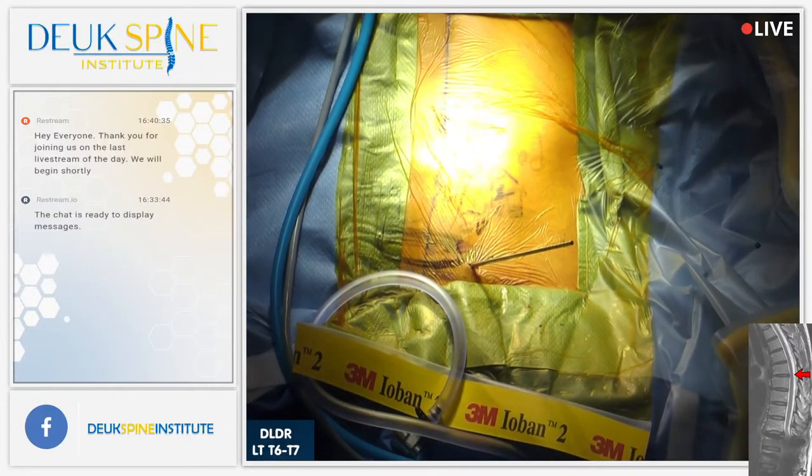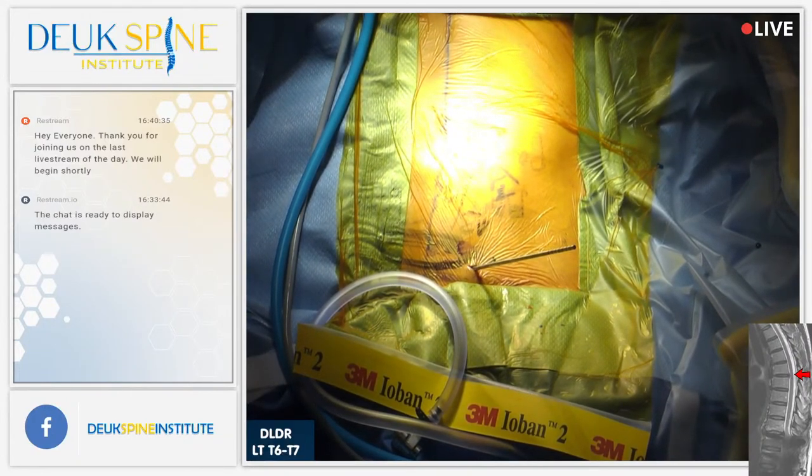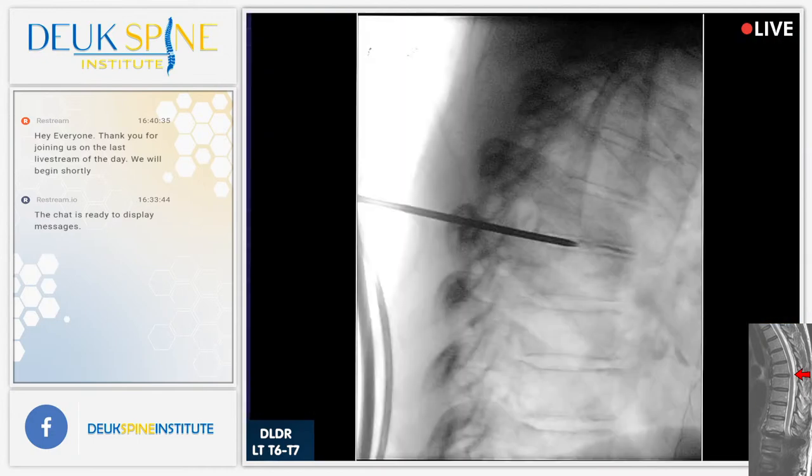All right, folks. So let's get a shot. At this point, we've accessed the disc that we're interested in fixing, transforaminal left approach. Let's get an AP so they can see the trajectory. Once again, this is the first place in the world doing this surgery, Deuk Spine Institute. There is nobody in the world that's done endoscopic transforaminal surgery.